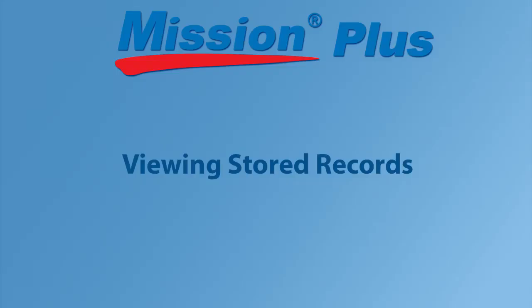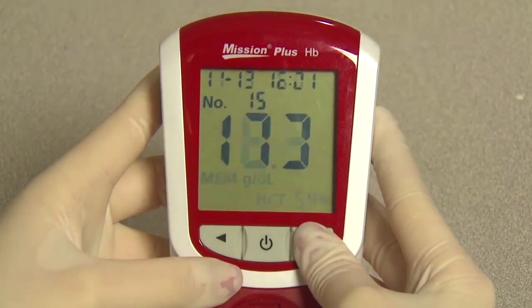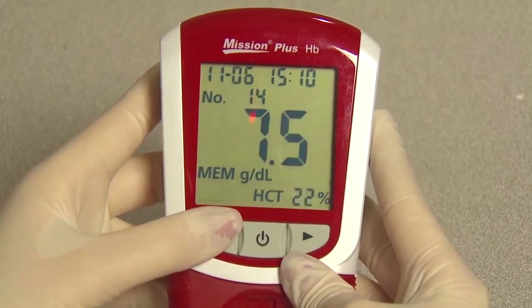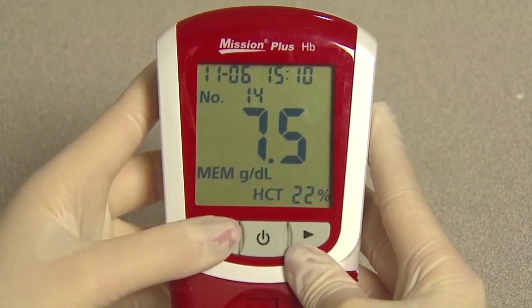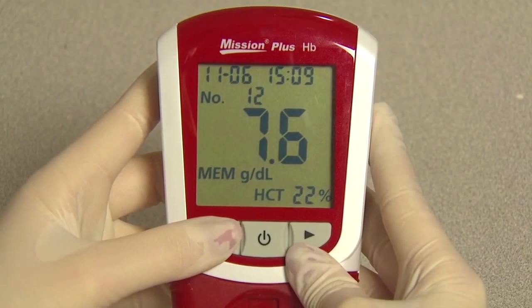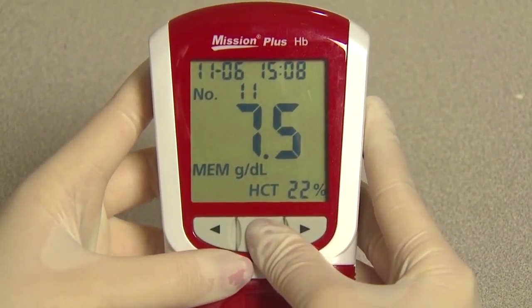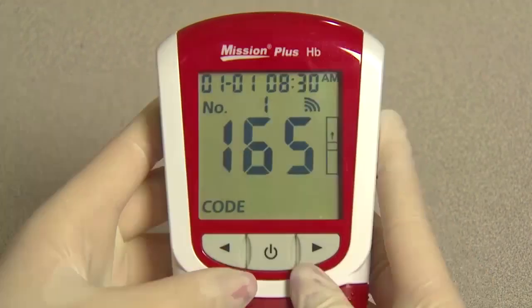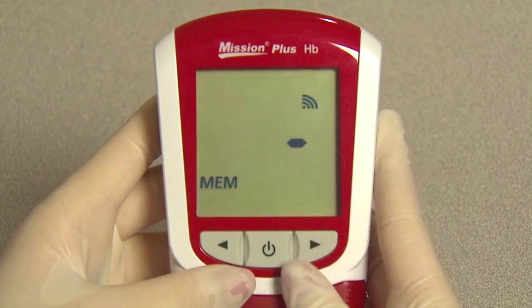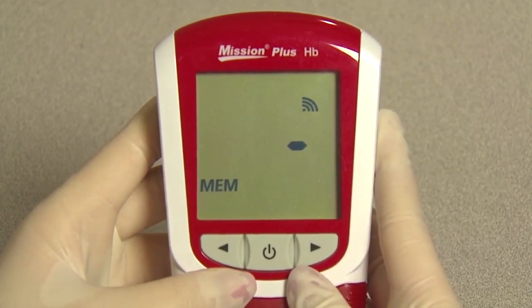Viewing stored records. To view stored records, from the initial screen, press right or left to show the first record. Press right or left to view each record in date-time sequence. Press and hold the power button to return to the initial screen. If no data is stored, the meter will display 1 dash and MEM.